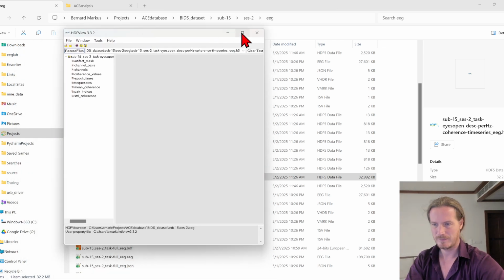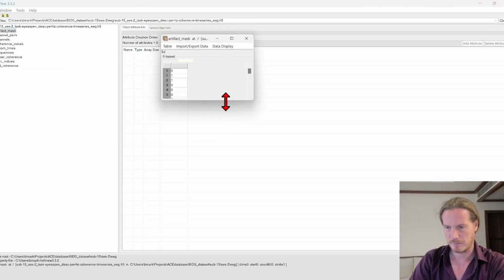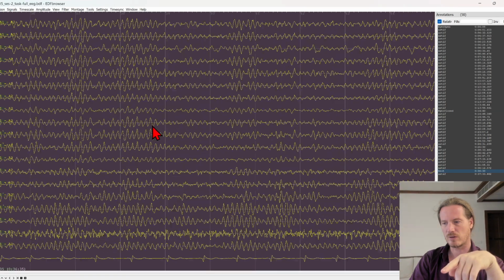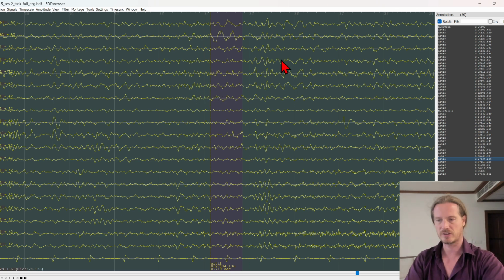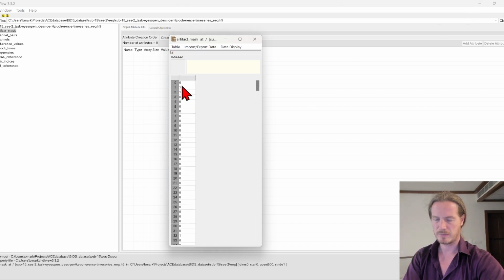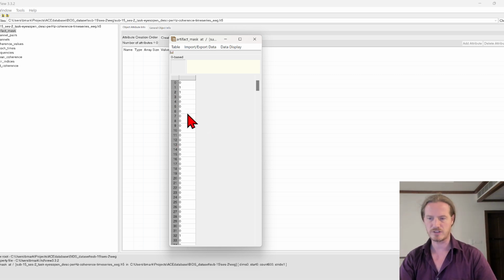All right, so this is what we get when we open that file. And first there is a table that shows us the artifact mask. What does that mean? Earlier I showed in the EEG data, we could see all of the periods where we mask a period as being noisy. So these periods of noise, we can see that. And so this little section of time gets masked, and it goes per second. So here we have a mask, and this whole list, everywhere where it says artif, turns into this artifact mask, and it takes 1 second per entry. Basically if we have 10 minutes, we get 600 seconds, and then for every second it says whether it is masked with artifact or not. So the first second is fine, the second there is an artifact, then again, etc.